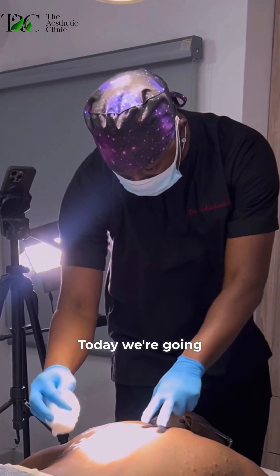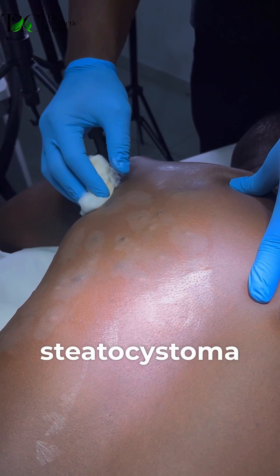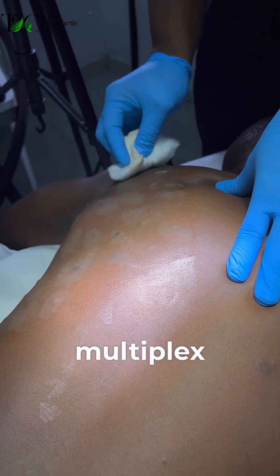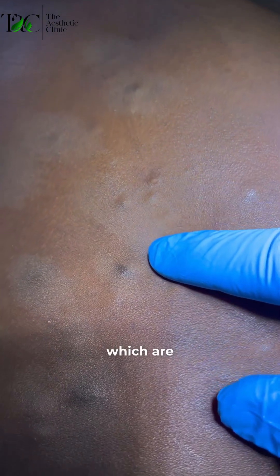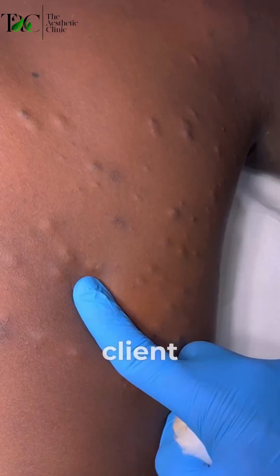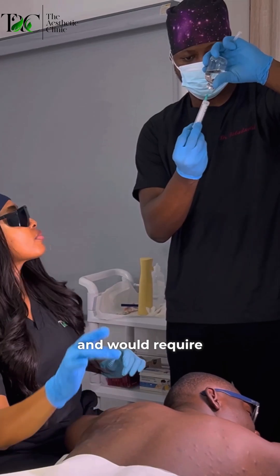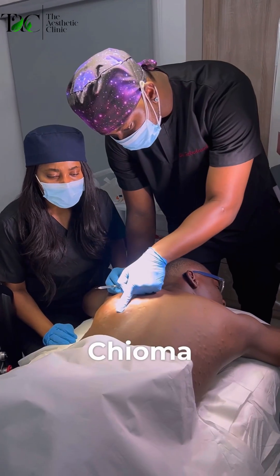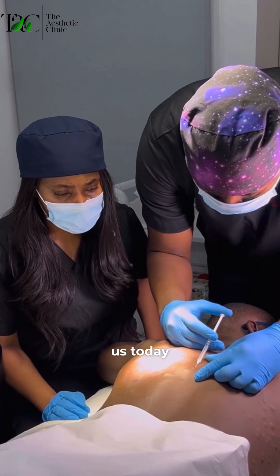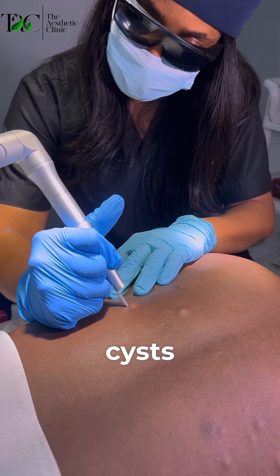Today we're going to be talking about a skin disorder called steatocystoma multiplex. It is characterized by the development of dermal cysts which are sebum-containing. In this client there are so many of them and would require many hands to make this work. Here I have Dr. Chelma, she's going to be assisting us today. We're going to start with numbing most of the cysts.